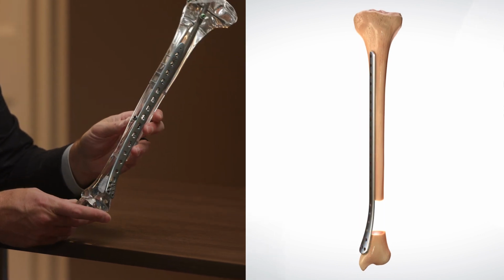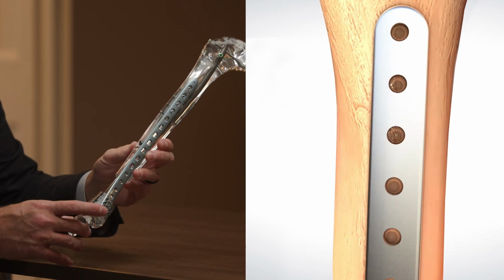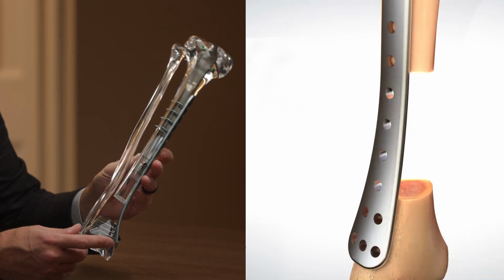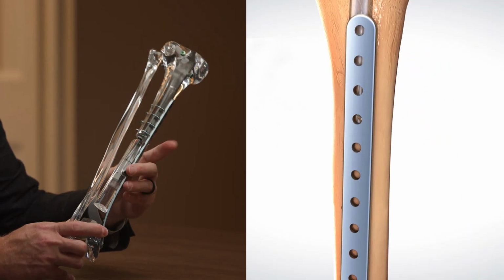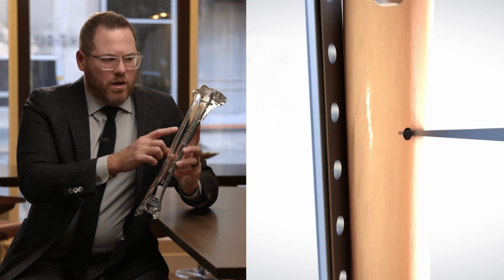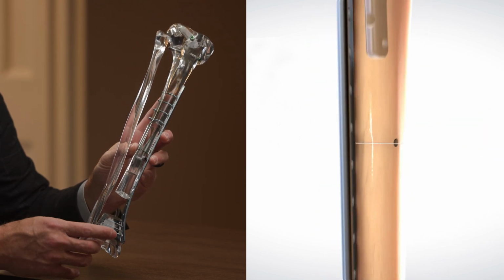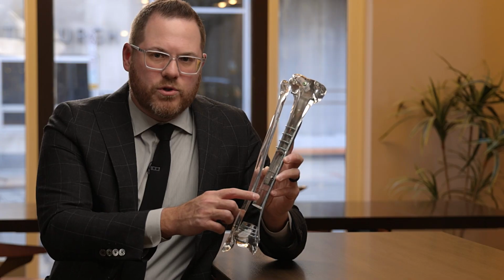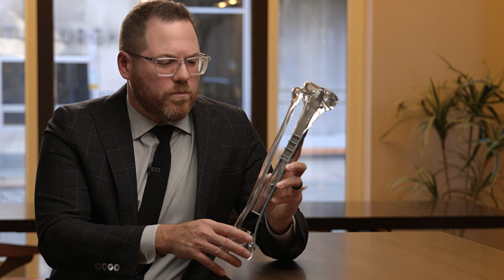Here you can see the plate. This is a medial-based plate on the distal tibia. This plate is serving as railroad tracks, effectively. We are connecting the distal segment to the proximal segment. The intramedullary nail, as you can see here, is placed as with any standard tibia intramedullary nail for fracture, but in this case, it is stopped short in the segment that we are wishing to transport.